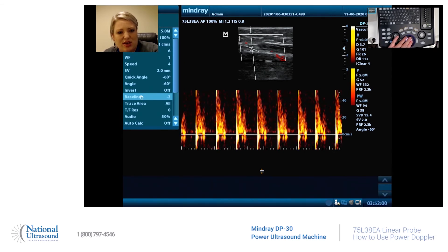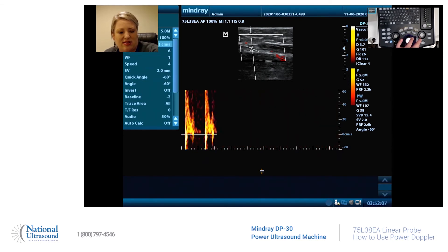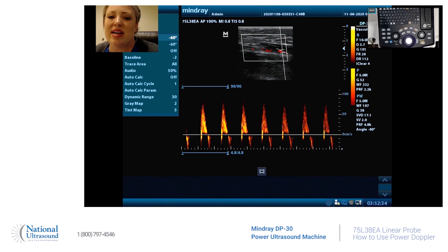You're going to put your cursor on, and you're going to change the baseline. You are also going to increase your scale. Let me hit update to get the best image possible.